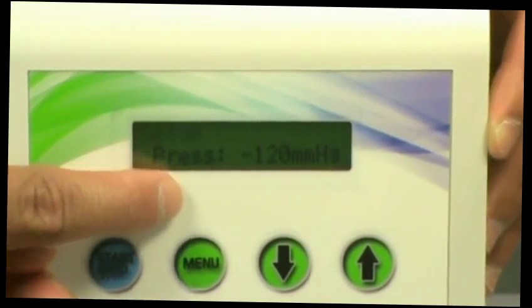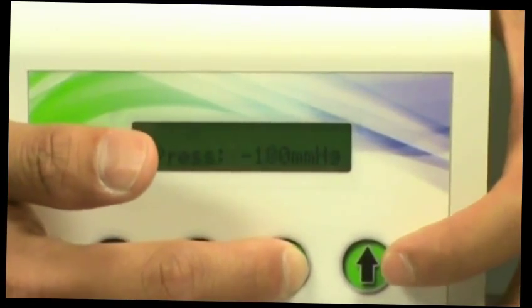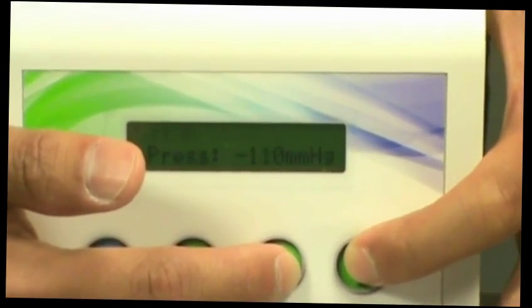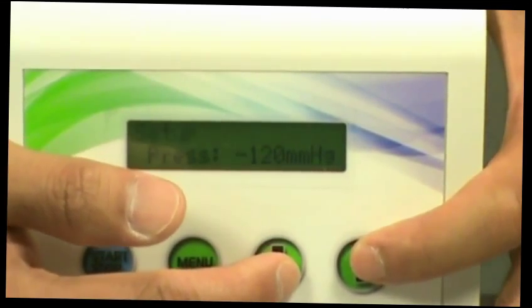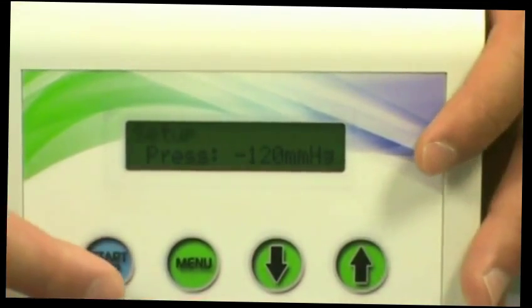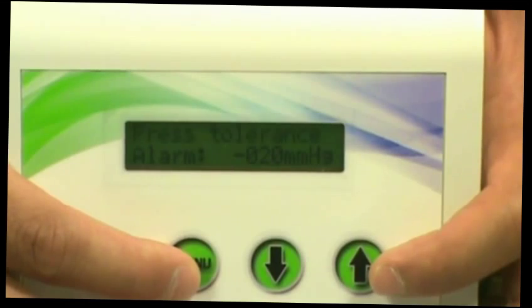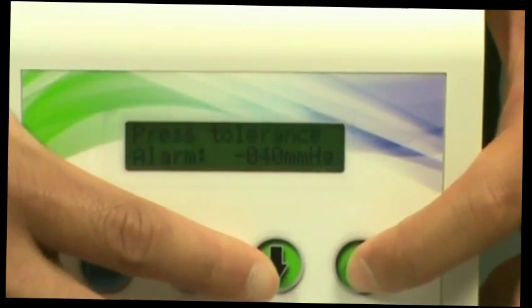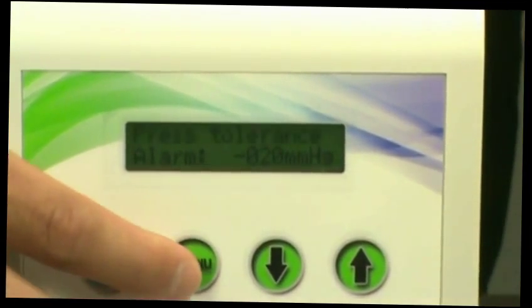First it will be your pressure setting. You can adjust it by pressing the down or up button. Press the menu button. And we will set our pump for 120 millimeters of mercury. Press menu again. It will take you to the pressure tolerance. You can also adjust this by going up or down, pressing the up or down button.